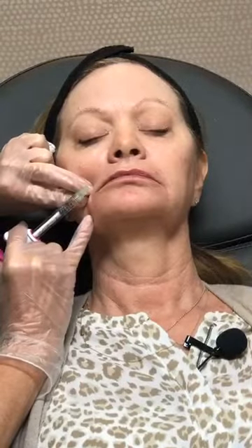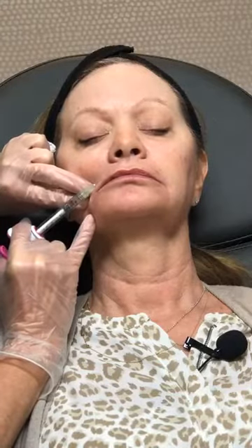And this is what everybody wants, these fine lines to go away. But in the end, that does look a little bit better, but in the end, it's more about the Secret RF, the skincare, that kind of stuff versus the filler alone. But you want to do collagen stimulation beforehand, so that's why you got your 3 in. Yeah. And then you'll probably want to do some more Secret in 3 to 6 months. You could do it quarterly, you could do it annually. I feel like there's not enough collagen stimulation. I could do it monthly still and still be like, I want more. I think that's softening that up nicely.